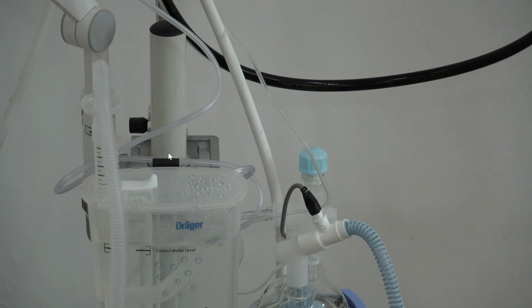Linda, would you like to add anything on the NO integration here? I really don't think that nitric oxide warrants being given in any CPAP situation, because it's not an active ventilatory method. It remains a passive ventilatory method. I really don't understand that, and perhaps it's in a very advanced unit, but we would not give NO in a CPAP situation. The patient is usually weaned off it by the time we get there.